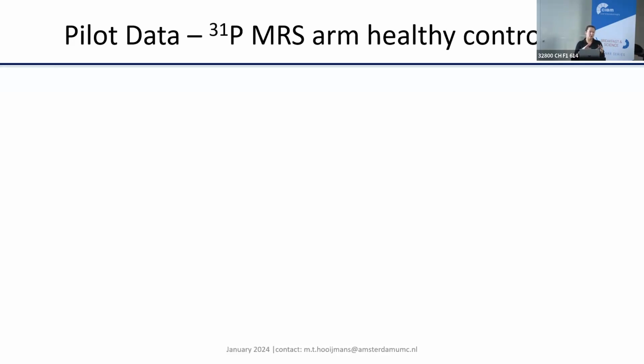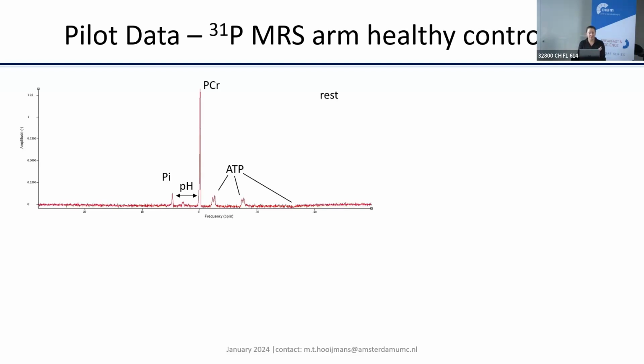And the thing was that we only had a surface coil for phosphorus. And so we were using the bore of the tunnel to do the proton imaging back then. So we've been working to optimize both data acquisitions, so the phosphorus part to look at mitochondrial function. To give you an idea of what a phosphorus spectrum with the surface coil looks like.